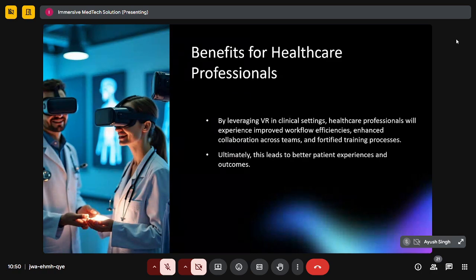And I would say one more thing, that it is not just limited to the medical data set. Even if we need to do any sort of material reverse engineering, since it is working on a threshold based approach, we can also use it for material data sets. I used the software for one such 3D rock sample that I was having, and the result accuracy was quite high. Further, this also tells us that we are just limited by our thinking. If we expand our thinking, we can use the technology in any domain that we require.